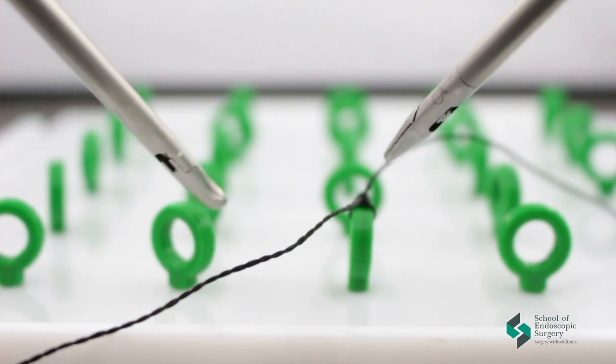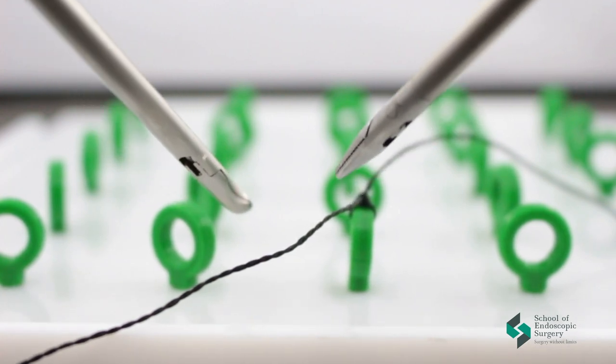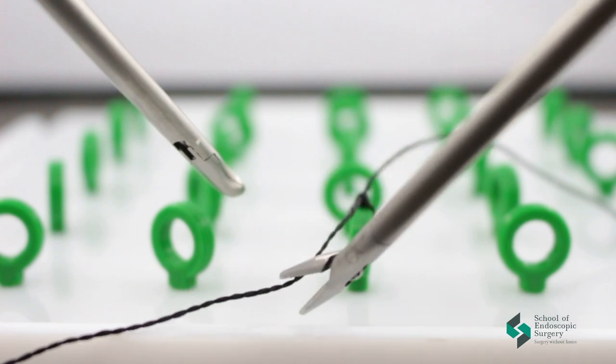Hello friends! Today our exercise is about the intracorporeal knot. What does intracorporeal knot mean?